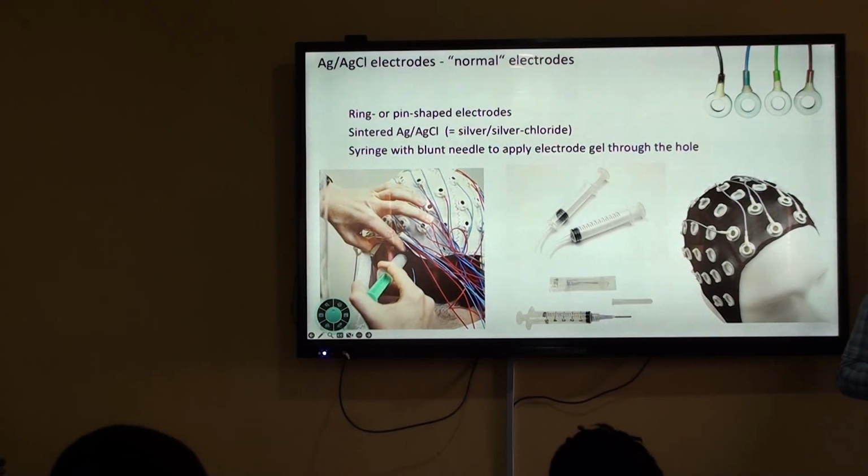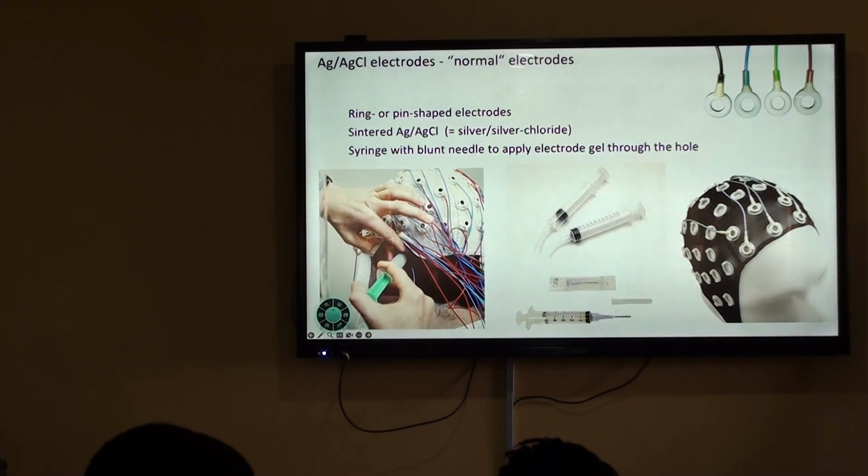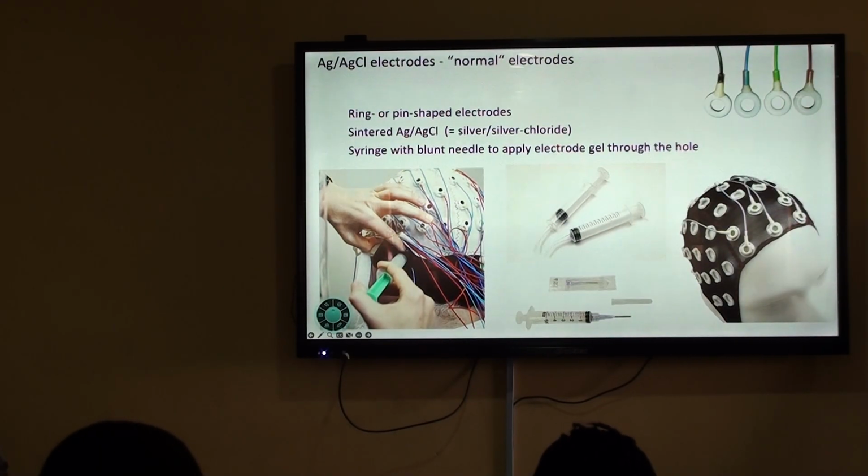Based on the hair texture, what we use in our lab is actually the bridge cap. We use bridge electrodes because they accommodate whatever hairstyle the person is coming with. And because you have the retractable rubbers, you can either expand or reduce. So that works for us.